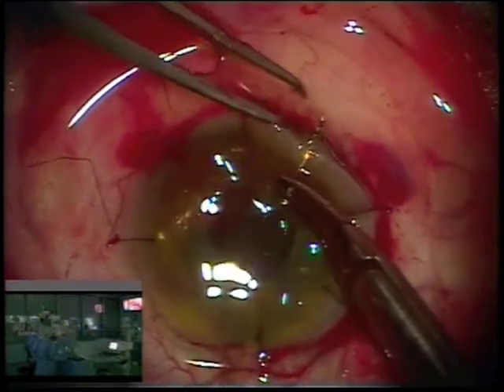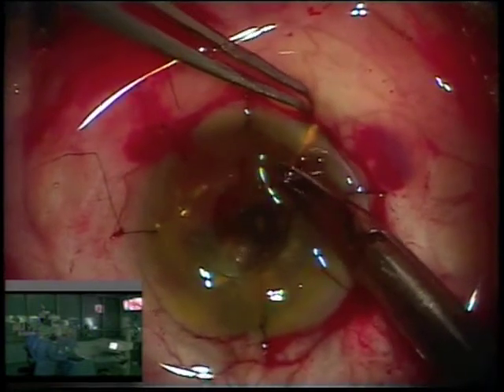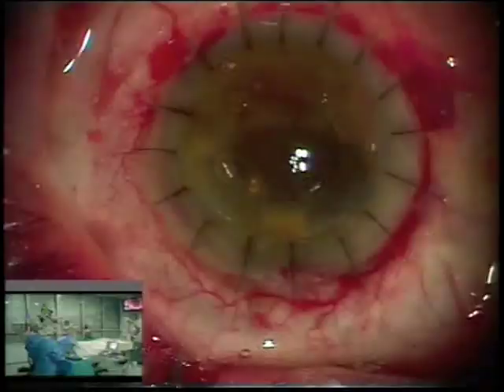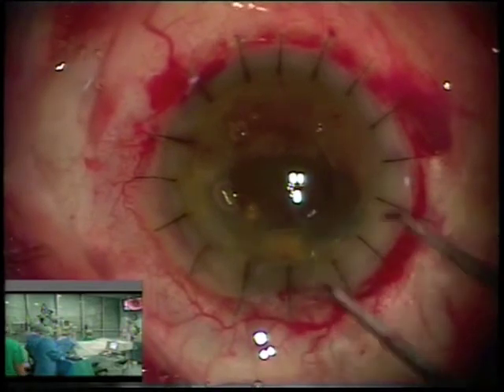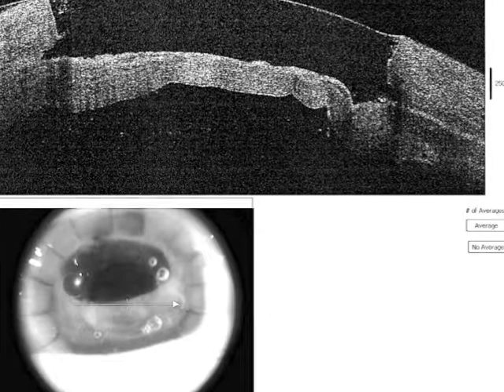You see almost full-thickness sutures on the donor and almost full-thickness on the recipient — very important to re-approximate the lips of the transplant. And here: transplant and prosthesis together. Immediately on cornea OCT you can see the fabulous fit of the prosthesis on the donor vehicle cornea.